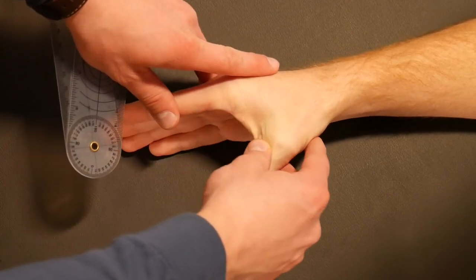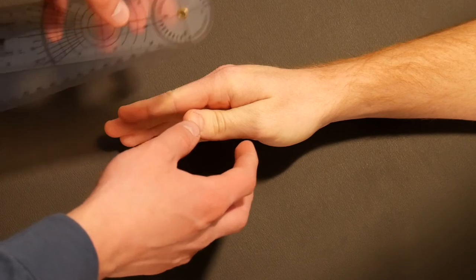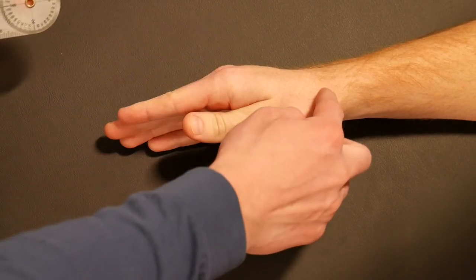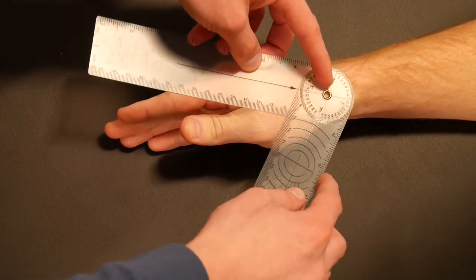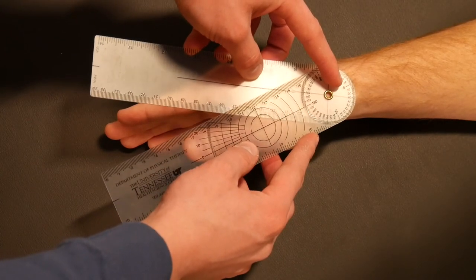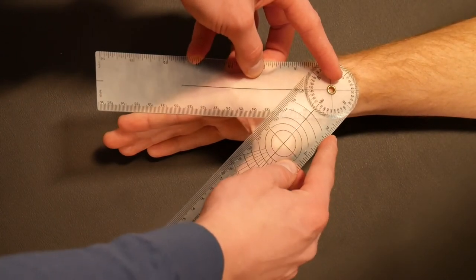Another, less frequently recorded measurement is thumb CMC palmar abduction — where the thumb abducts away from the palm. Goniometer placement follows the exact same principles as radial abduction: axis over the CMC joint, stationary arm in line with the second metacarpal, moving arm in line with the first metacarpal. As the patient moves into palmar abduction, follow the mid-shaft of those bones to record that motion.